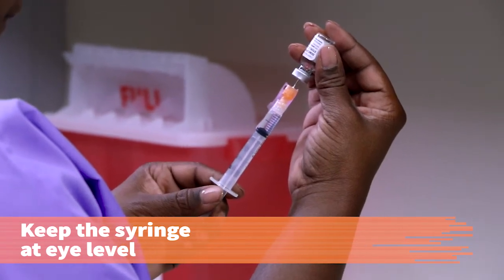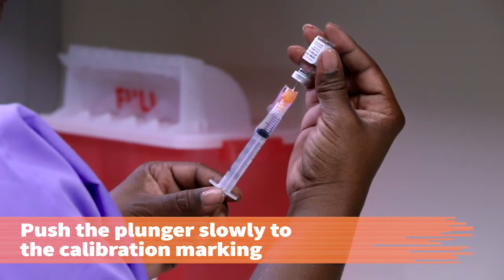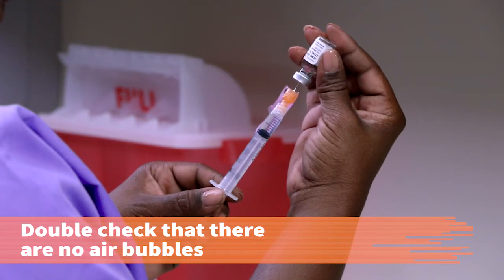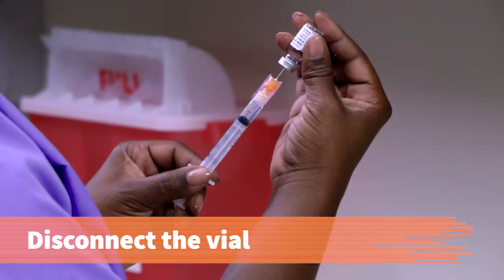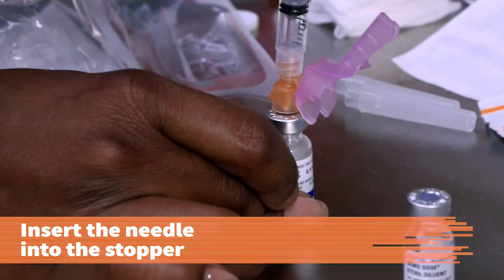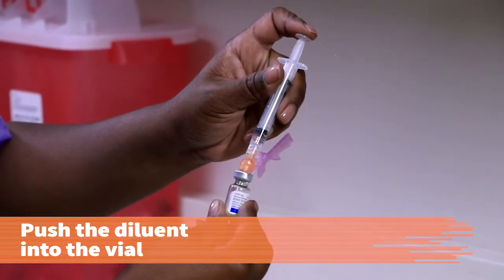Once all the air bubbles are at the top, push the plunger slowly to the correct calibration marking for the ordered dose. Double check that no air bubbles are in the syringe and that the right dose was measured. If everything is correct, disconnect the vial from the syringe and needle unit. Insert the needle into the stopper of the powdered medication vial. Push the diluent into the vial.